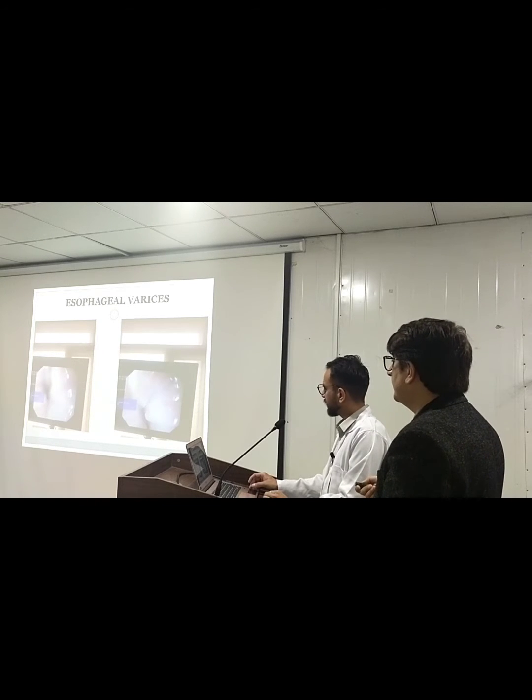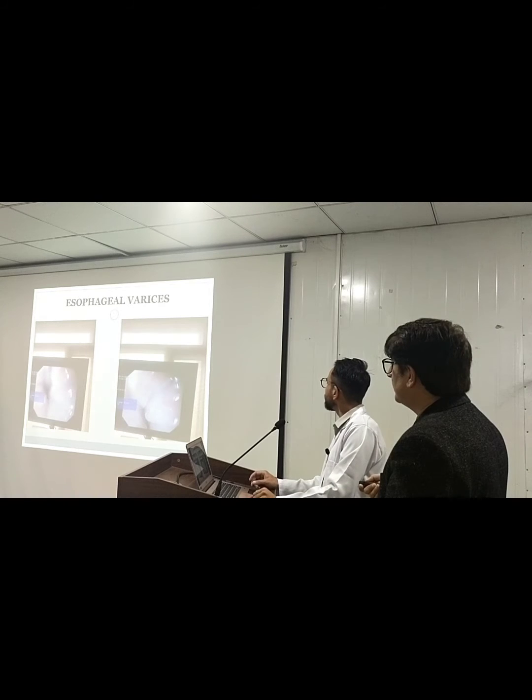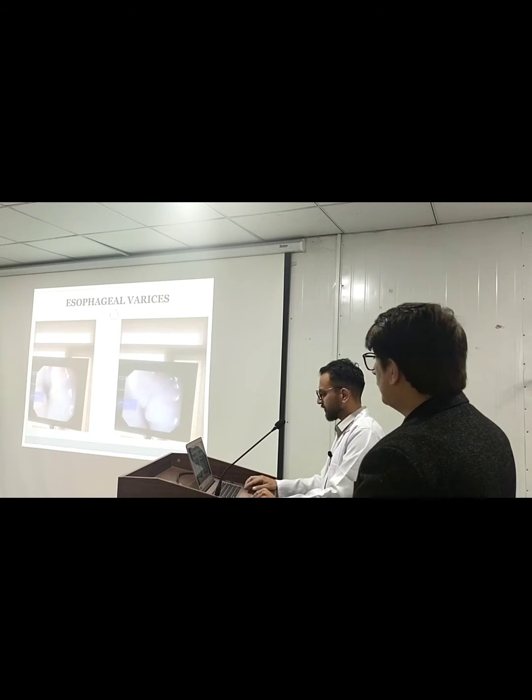Again he presented with esophageal varices. The pictures are not very clear, but you can appreciate the multiple columns of esophageal varices. The patient presented with upper GI bleed. So the second time we did his esophageal variceal band ligation endoscopically.